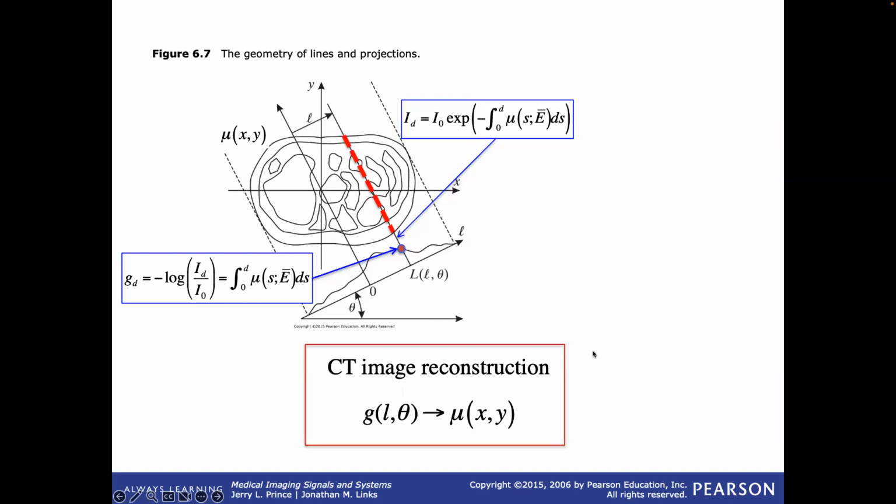you can imagine now how this is being done, right? Now that deep learning and large transformation engines are available, if you have traditional, very good but slow methods with a physical model for going from this to this, you only have to do that about 1,000 times, or maybe 10,000. Feed that into a deep learning library and it learns how to do it, right? And it does it really well. So all of this is going to be done by deep learning fairly soon.